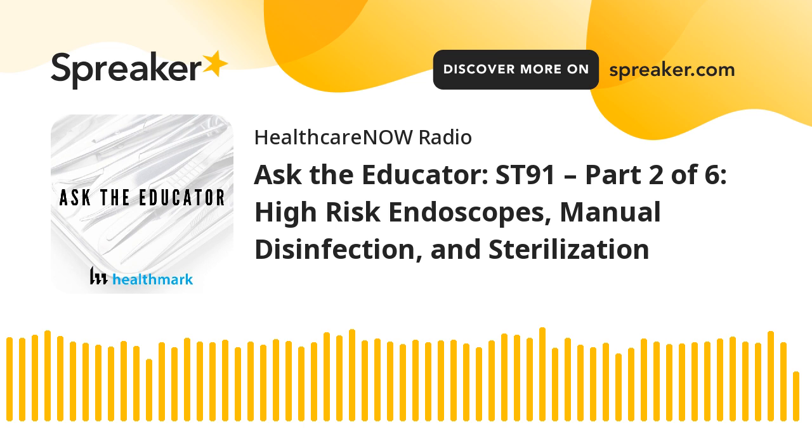You have to have the ability to still do emergency type procedures. So that doesn't mean you can get rid of it altogether, but we do want to see the industry migrate to using AERs. There are many types available on the market, from small tabletop ones that might be more appropriate in your smaller, lower volume facilities, to really big ones that do 2 or more at a time that may be appropriate elsewhere. But big change there.